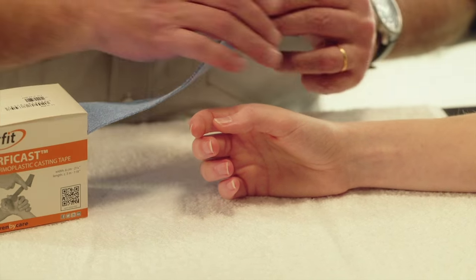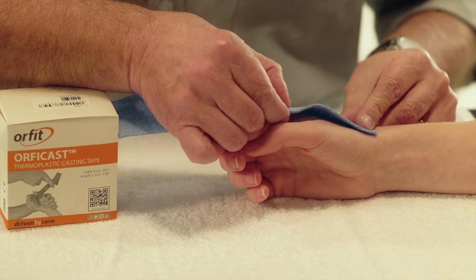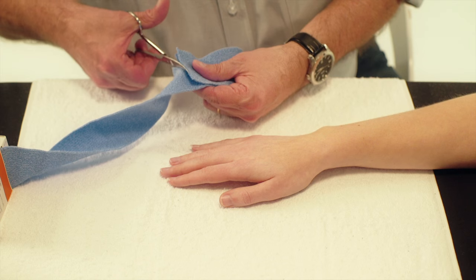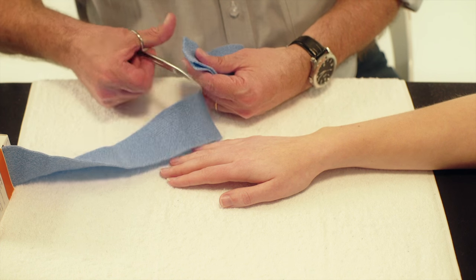Take a piece of Orphicast of 6 cm wide. Measure 2 times the distance between the first web space and the base of the thumb and cut the Orphicast accordingly.